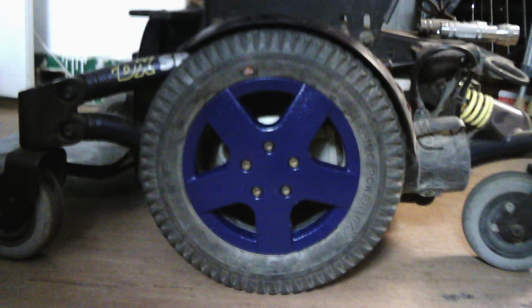This is a look at the hubcap after it was reinstalled on my wheelchair. I'm very pleased with the results. I'm not showing in this video how to remove and reinstall the tire on the wheelchair. It is an intuitive process. However, I do want to mention I use the same tool as is used with bikes to remove the tread from the hubcap. You could go old school and use a few butter knives, whatever works for you.